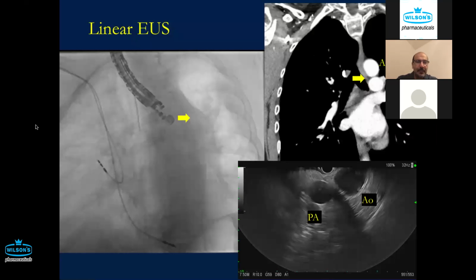If you take the image of the scope in the different areas of interest and then correlate it with the CT, that may allow people to understand this better. So we're in the esophagus. As you can imagine, the patient is typically lying on their left side, so our probe by default goes in facing the left side. As we come into the upper esophagus, this may make more sense to people who are actually doing EUS currently, as opposed to somebody who's never done it. But if you do this over and over, I think it does make sense. I'll come back to that point later in my talk.